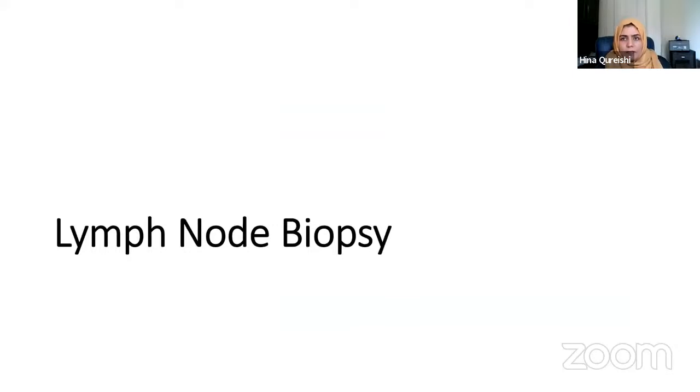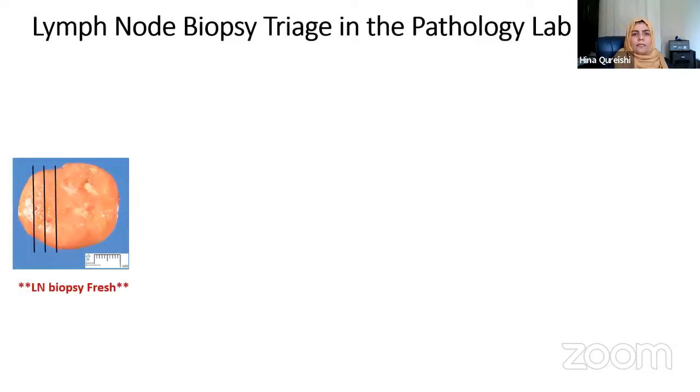Lymph node biopsy: I'm going to briefly talk about how we triage the lymph node biopsy in a path lab. And similar to bone marrow biopsy, we have to split the lymph node biopsy in order to get the maximum amount of diagnostic testing and data to come up with an accurate diagnosis.